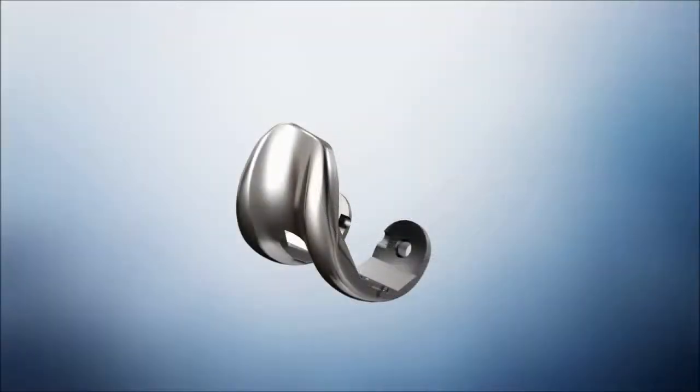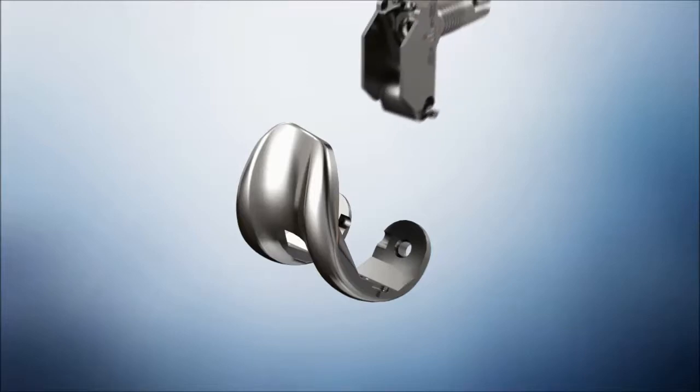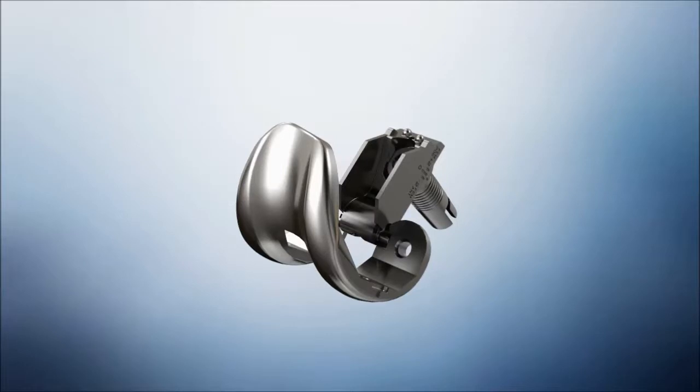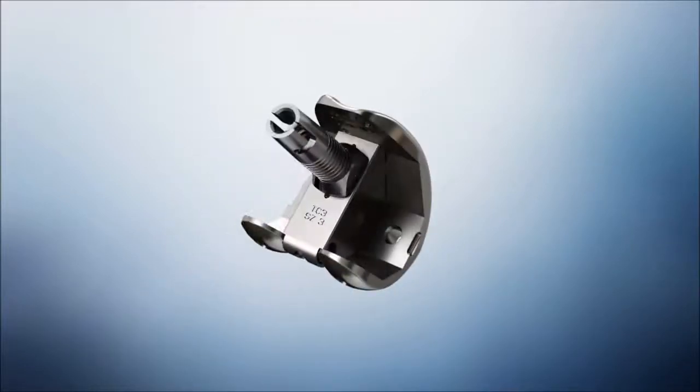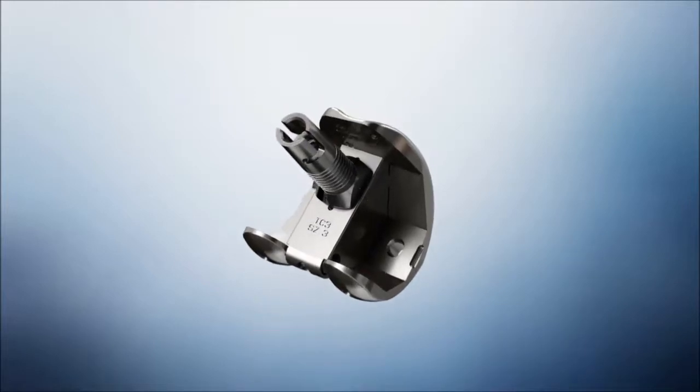Assemble the femoral trial by selecting the appropriate size femoral trial and box trial components. Place the two posterior outrigger tabs of the box trial into the recesses of the posterior condyles of the femoral trial. Rotate the box trial so that it comes into contact with the anterior flange and the adapter trial is pointing away from the distal surface. Use the HP Revision screwdriver to tighten the hex screw at the posterior of the box trial until a click is heard from the screwdriver.